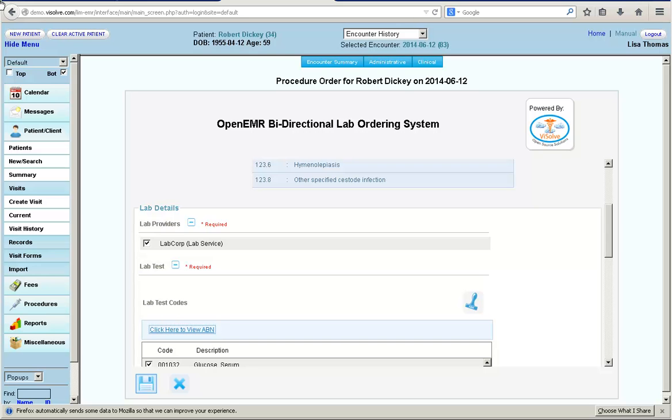Depending on the eligibility, Dr. Lisa saves the lab order. Should the doctor want to make any changes to the lab order, now is the time. Once the order is sent to the lab, the doctor can make changes only by calling the laboratory.